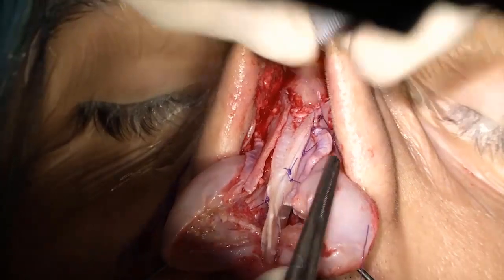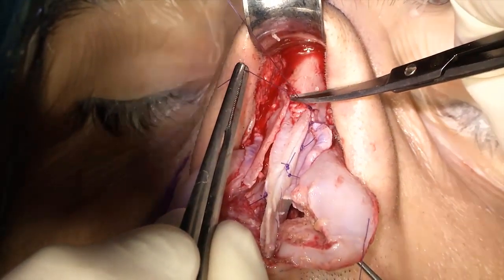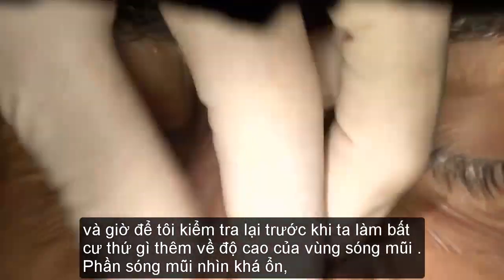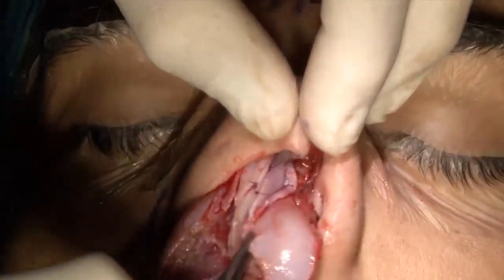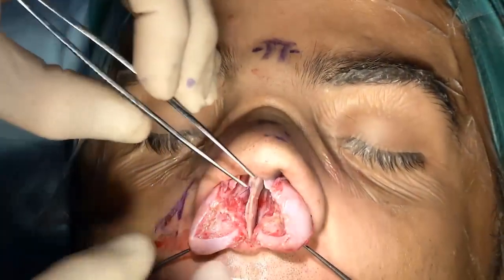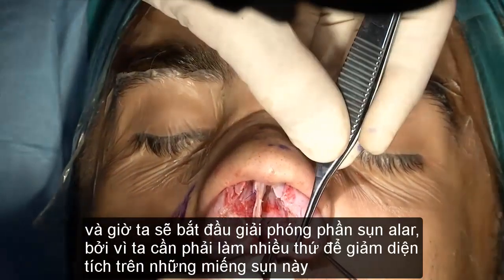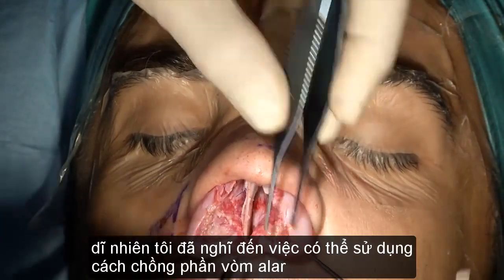So let me just check before I do anything else the height of this dorsum. Height of this dorsum looks good. And let's start freeing these cartilages, because we will have to do a sizable work on these cartilages, of course.